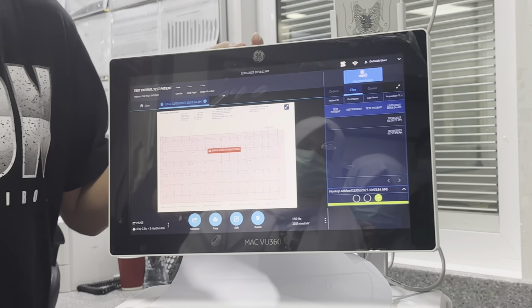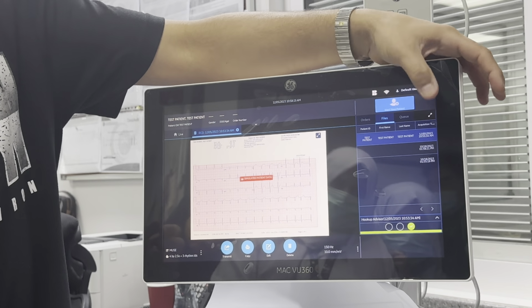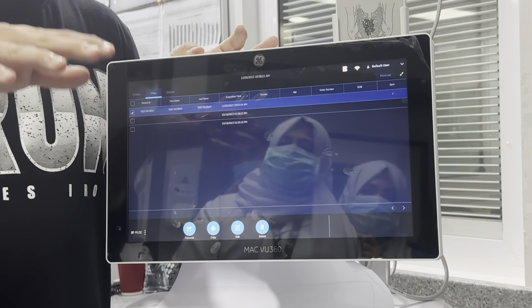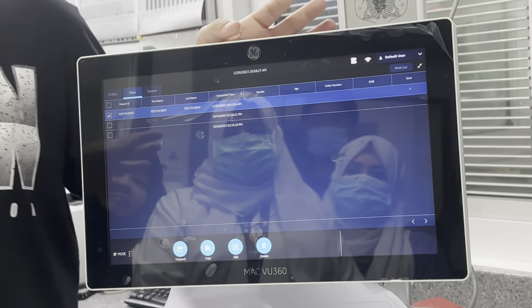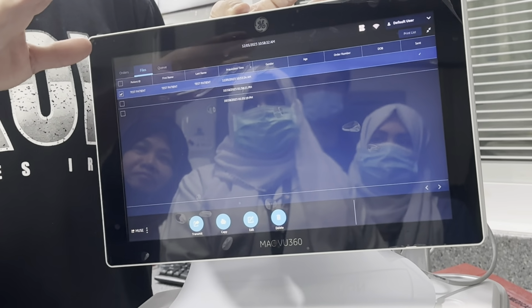Now what's really needed to be checked in this list, that I have the 2 arrows in here, and you have to know that, maximize, with this version of our machine, you can save up to 1,000 reports in this machine. 1,000 is not a small number, okay? But unfortunately, it will not do an auto-delete when it is full. So it depends upon your workflow here.